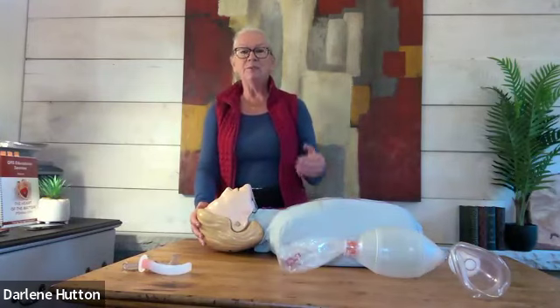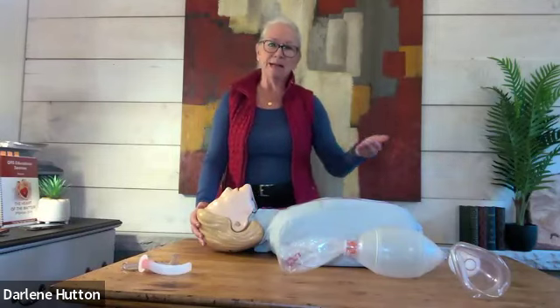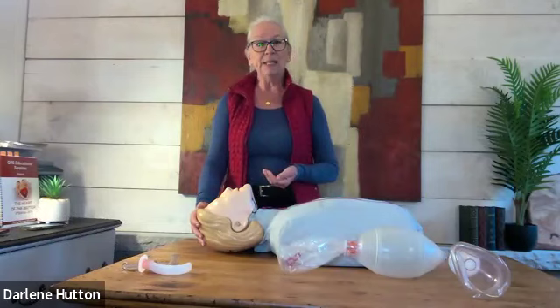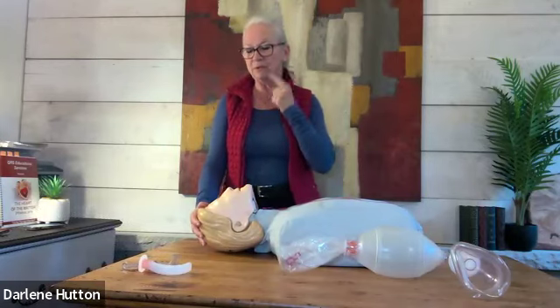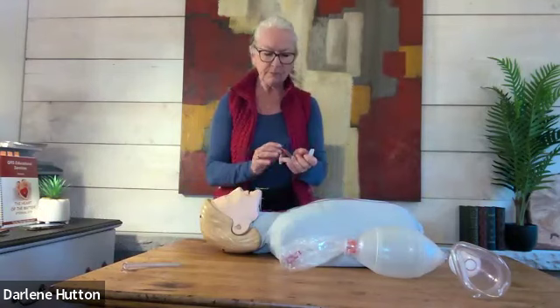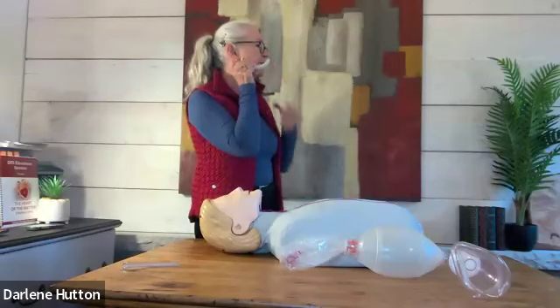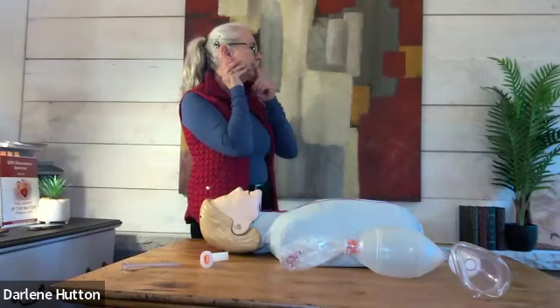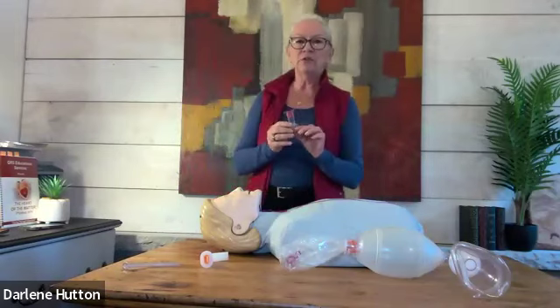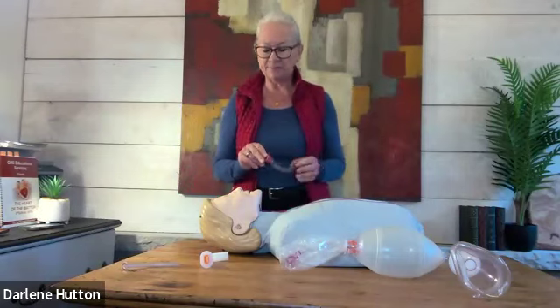So the next thing I would do, because I have airway management kits in my bedsides, in my clinics, if that's where you're working, is insert an oral airway. Oral airways are sized from the angle of the mandible to the entrance of the mouth. I've got two here, and you can see the angle of the mandible to the mouth. This one would be a bit too long for me. This one is good. The only contraindication to putting in an oral airway is if the patient has a gag reflex.